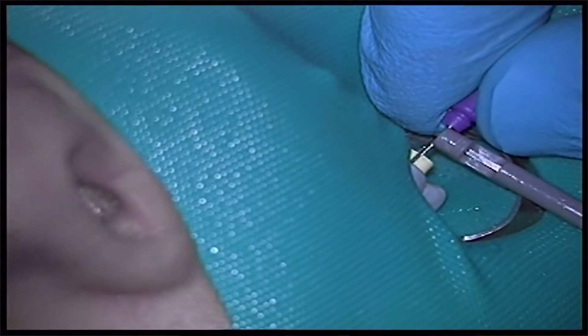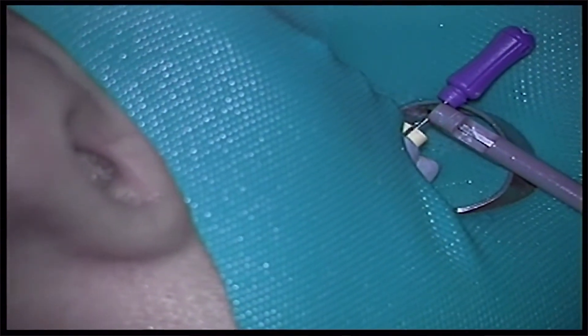Push the file back out into the periapical tissue — if it tells you you're long, then pull it back into the canal and it tells you you're right there, that's your working length. Put your stopper down to your reference point, your cusp tip, pull it out, do your measurement, and now you have your accurate working length.